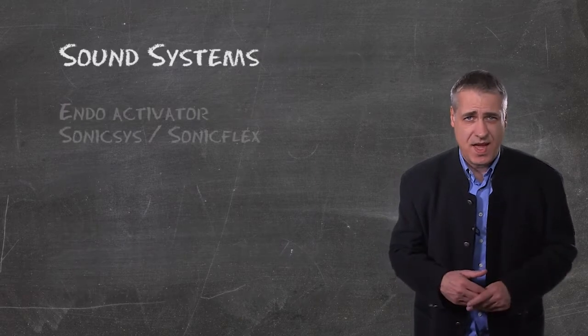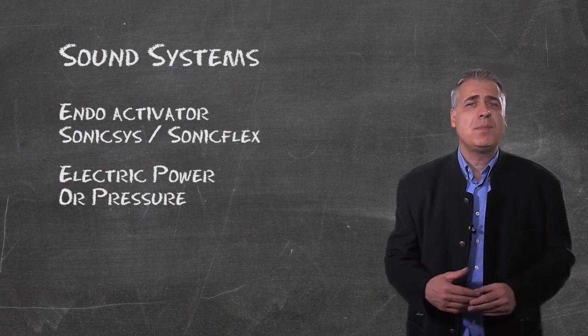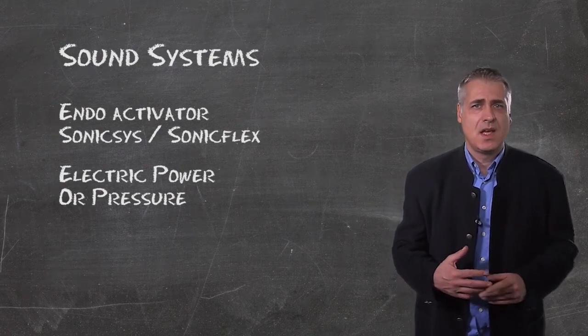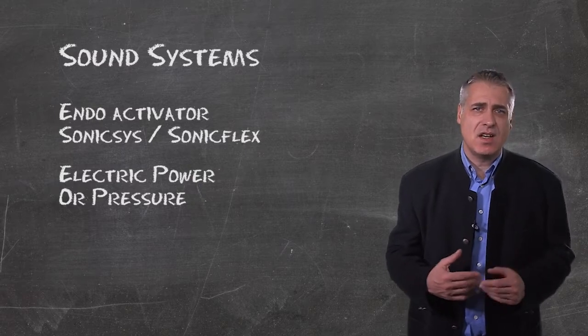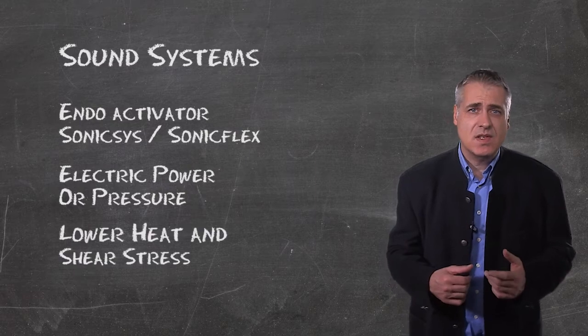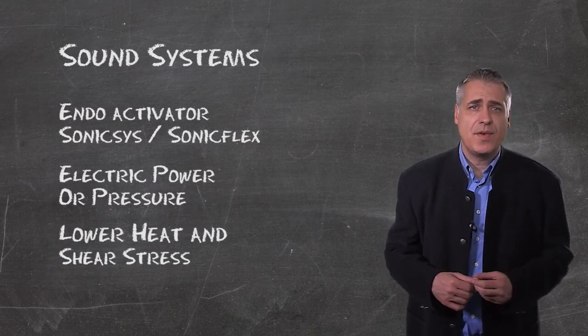Sound systems like the EndoActivator or the SonicFlex system work with electric power or with pressure to make the file oscillate. It works with less energy and a lower frequency than the ultrasound systems. This results in a lower production of heat and shear stress to the file.